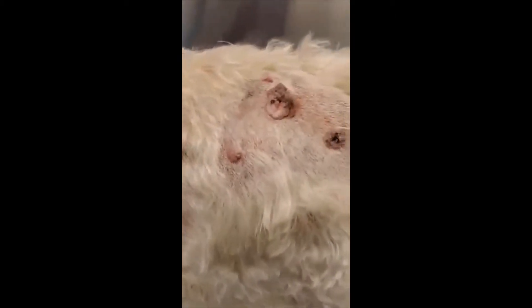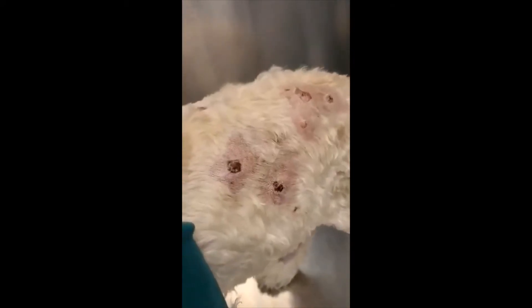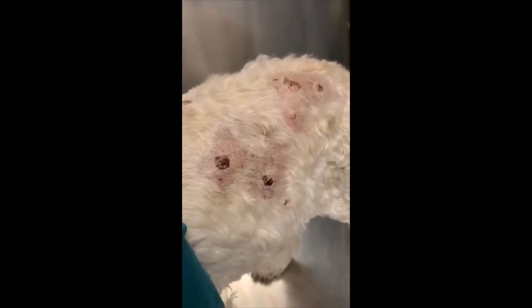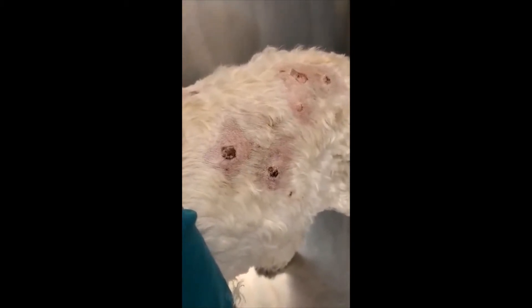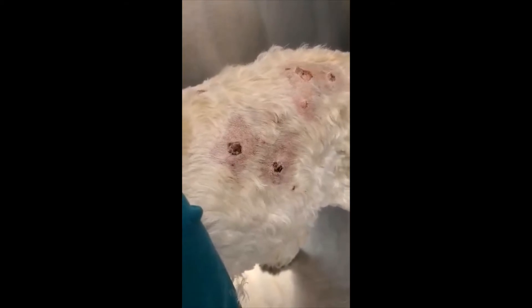As you can see, they're quite extensive, and surgical removal would be both quite involved as well as create quite an expense. The owner has elected to cryo all of these papillomatous masses in an attempt to forego an extensive anesthetic procedure.